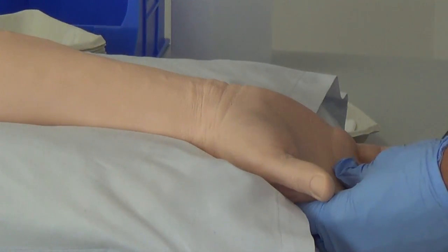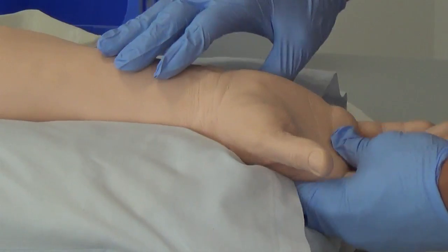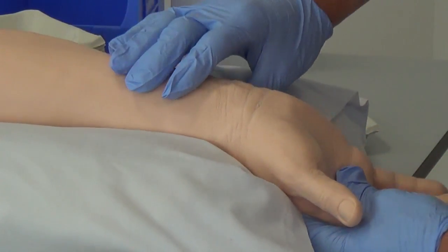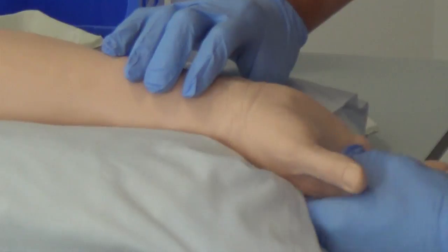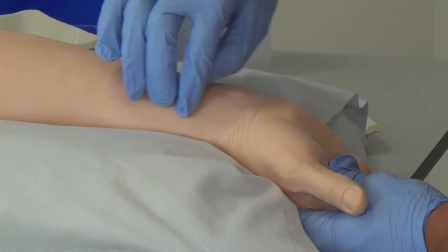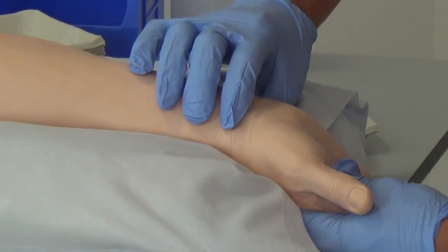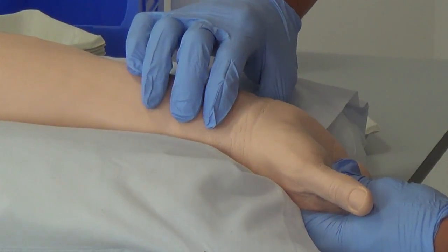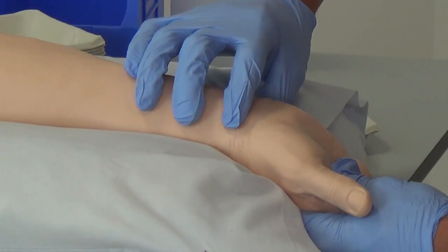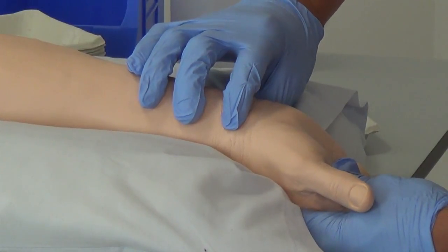To bring the artery to the surface and make it easier, you can ask the patient to cock their wrist backwards. As you ask them to do that, you can palpate and visualize the track of the artery. I can feel the artery there and I'm just going to plan the site at which I'll place the needle.